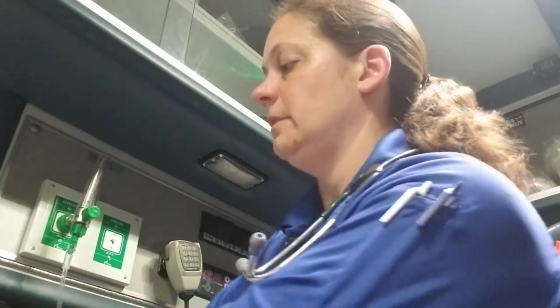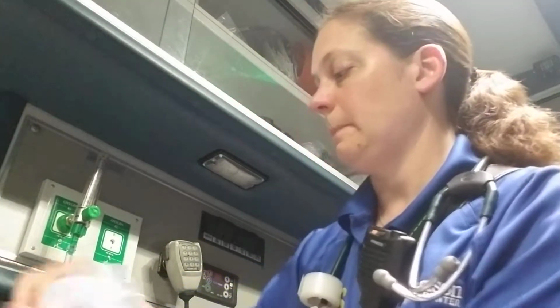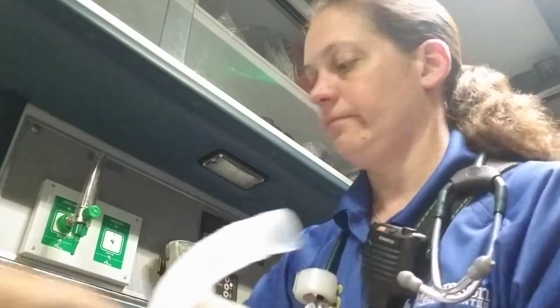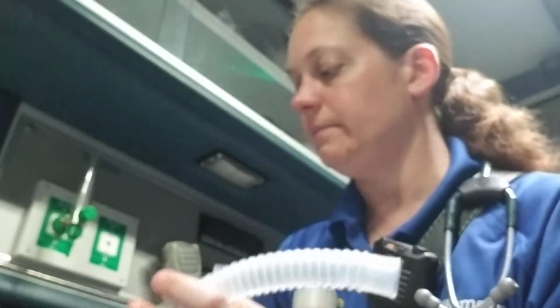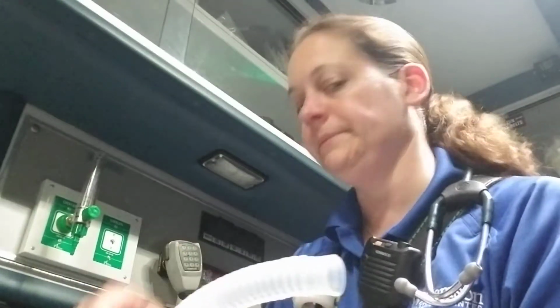So the first medication that we're going to do is the small volume nebulizer, which you can see the different pieces here. Some of them are already put together. So I want to position him on the side of the bed or the chair, wherever he happens to be sitting, and then just do a quick assessment. I need to check heart rate and rhythm, respiratory rate and rhythm as well, and listen to lung sounds, front, side, and in the back.